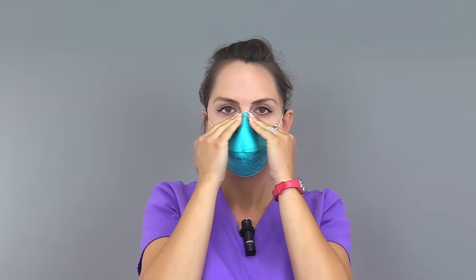Now, perform the seal test. This is performed to check if you have donned the respirator correctly and that it does not leak air. Always follow the manufacturer's guidelines for this part because it can vary between brands. Place both hands over the respirator, then take a sharp breath in and make sure the respirator is sealing over the face during inhalation. Keep both hands on the respirator and breathe out. While breathing out, make sure you feel for air leakage around the nose piece and around the respirator's perimeter.